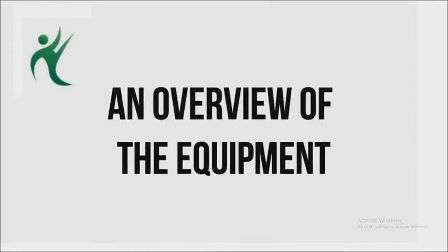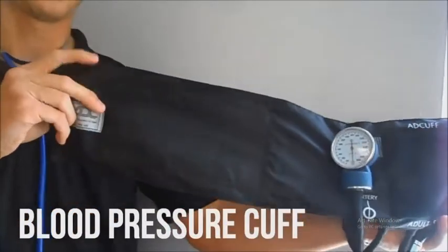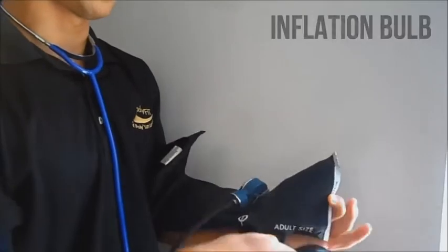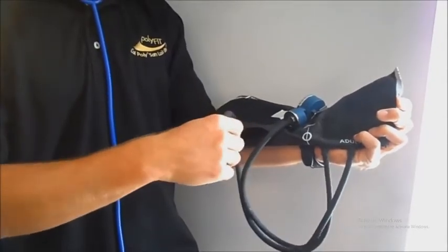Alright, so after we take the heart rate, we move on to blood pressure. There's some equipment that you need to have prepared for this. This is the blood pressure cuff, and this whole black Velcro thing is what you wrap around the patient's arm. And you have the pump right here, which you pump up to put air in, and that's what gets it tight around their arm.